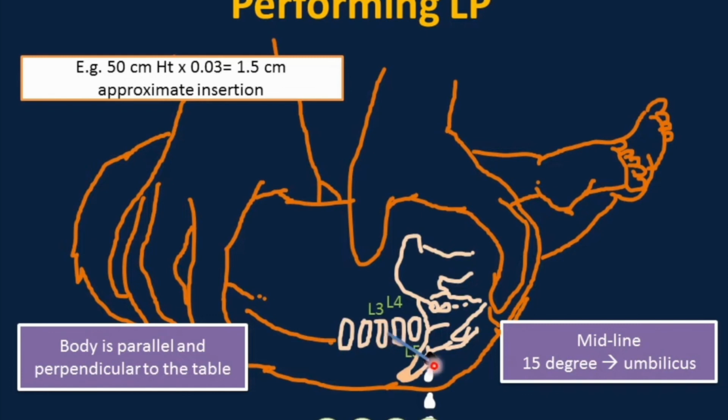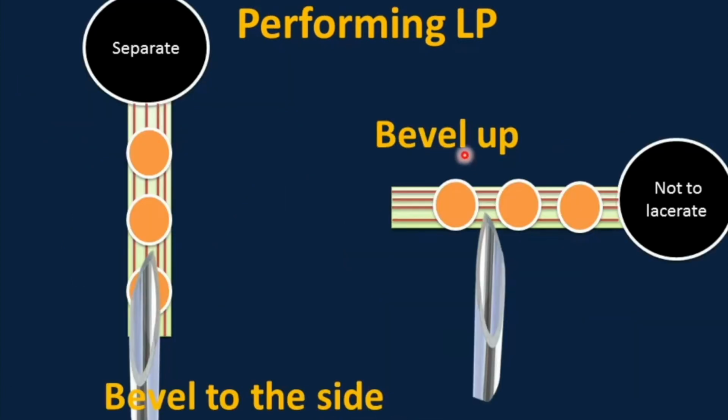When you insert the needle, it has to be with the stylet in place, and once you pass the skin, you have an option to remove the stylet slightly and advance it slowly until the CSF comes, and when you obtain the CSF, collect 1 ml in each tube. And then, as advised, 3 to 4 ml are enough for CSF analysis or studies. Then after it is done, insert the stylet and remove the needle, and then apply the bandage.